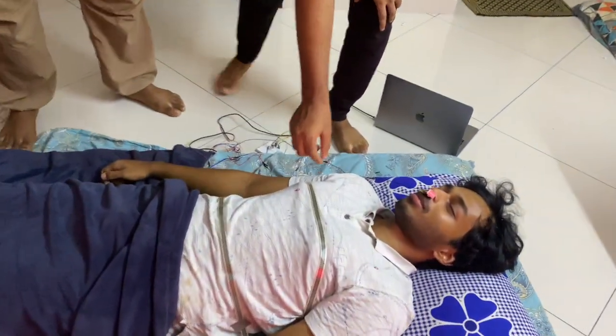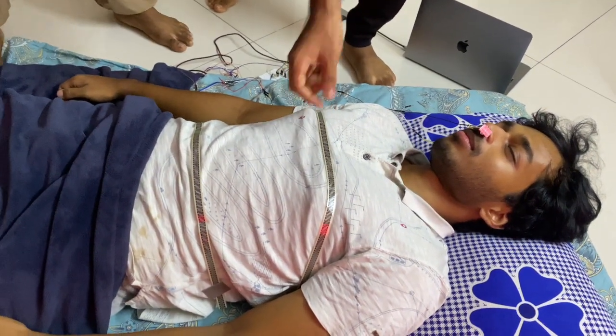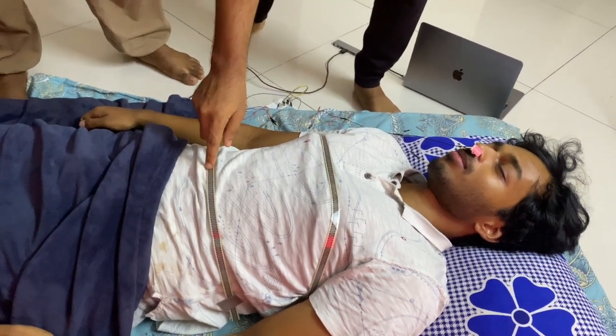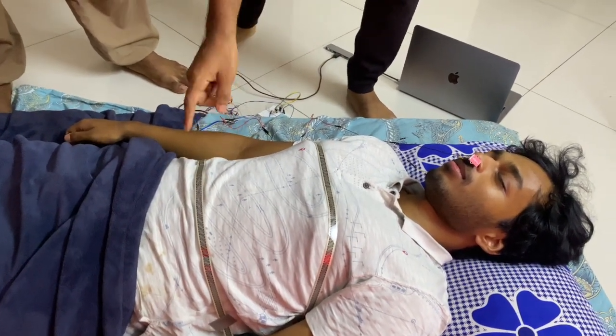Hi, we have a volunteer for our apparatus. Let's go into the details. The first thing here is the strain sensor, which will measure the thoracic movement of the human, and this is the strain sensor for the abdomen pressure.